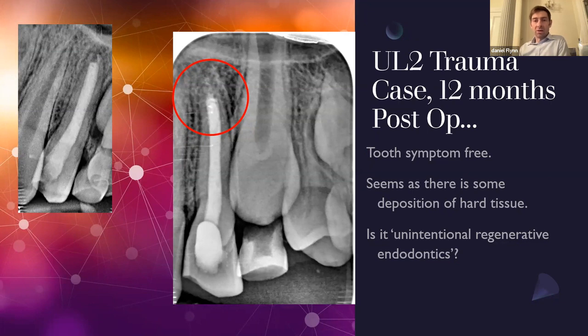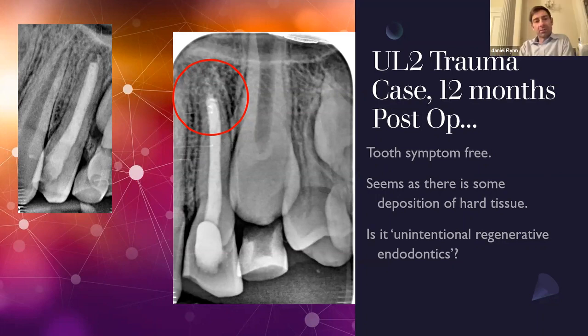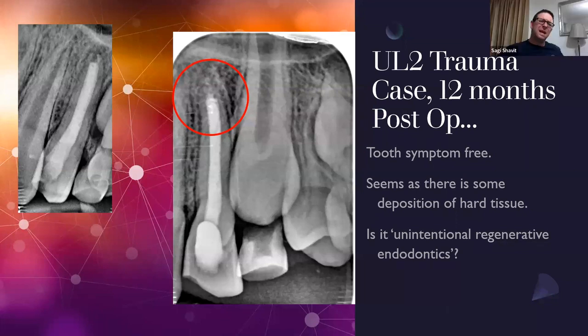There's another question here. What's the time rate of washout? Sorry? I presume they're asking about washout of the materials. Is it possible that they'll wash out? MTA as well, isn't it? Rather than the pre-mixed ones. Like the washout of MTA. Ah, washout. Yeah, I'm not concerned about it. If you can dry the canal and you can see that you don't have any bleeding or fluid coming out from the periapex into the canal, there's not going to be washout.